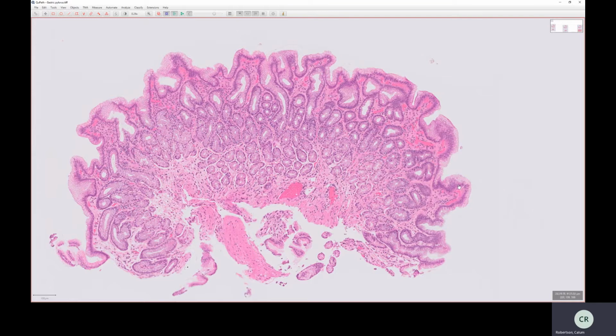One of the main diagnoses you make within this part of the stomach is chemical gastritis or chemical gastropathy, which is due to bile reflux from the small intestine, and it tickles up the stomach and causes it to be inflamed. And what you get is a bit of foveolar hyperplasia, which can give the crypts a corkscrew-like look, a wavy look.